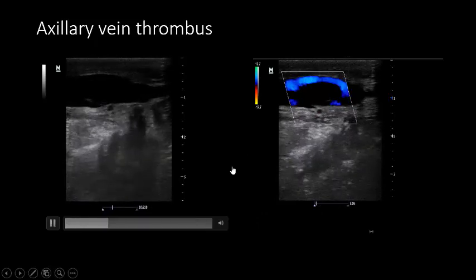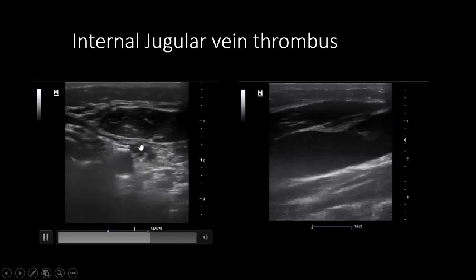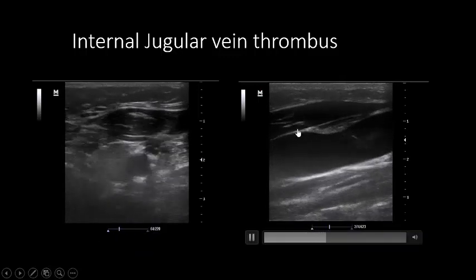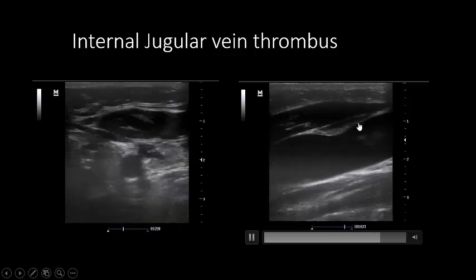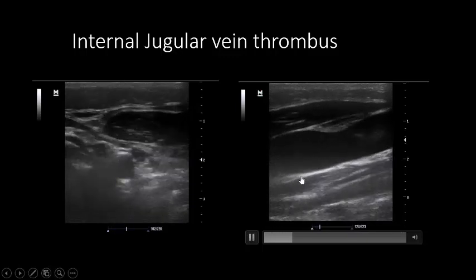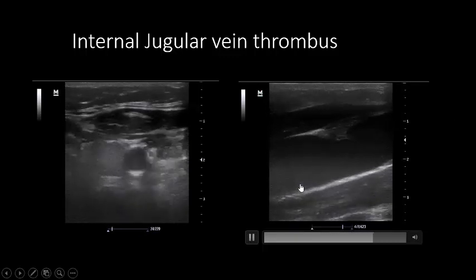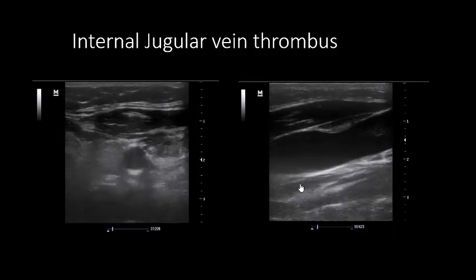And please consider the central line. You see here the left internal jugular with organized thrombus and no compressibility here. And here is fresh thrombus, central line related, moving inside the internal jugular with a hypoechoic thick wall due to phlebitis. This is very important, you consider. If you put the high frequency probe at the site of line insertion, you will very clearly see this thrombus. And if you see it once, you will not forget, believe me. Okay? So rule three, consider the line insertion sites.